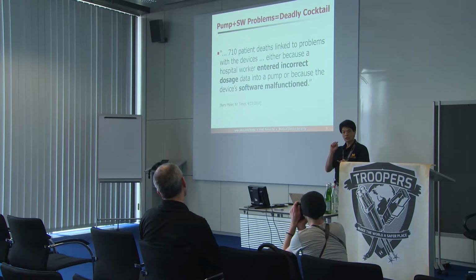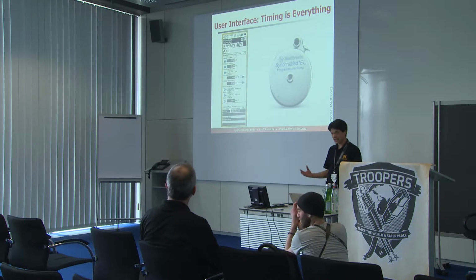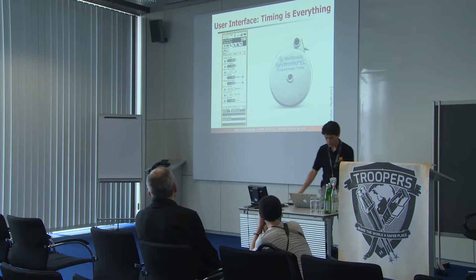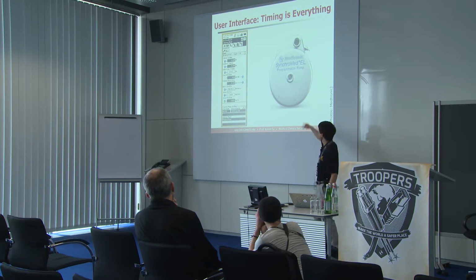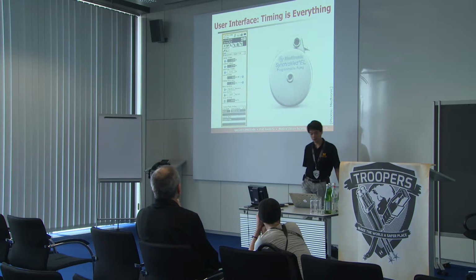That is, the nurse entered the wrong data, but don't blame the nurse. You got to think about the user interface too, as well as malfunctions in software. So let me give you an example of the kinds of really horrible user interface issues of recent history. This is an implantable infusion pump. It goes in typically in the abdomen, and you can see it has this little semi-permeable membrane where you can replenish the drugs, and a little port where it can dose the drugs into the body.